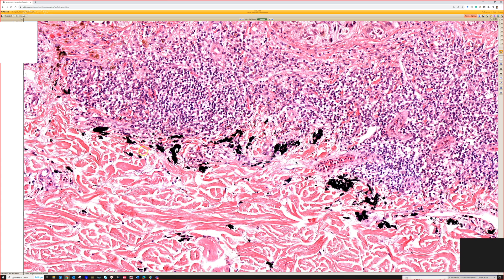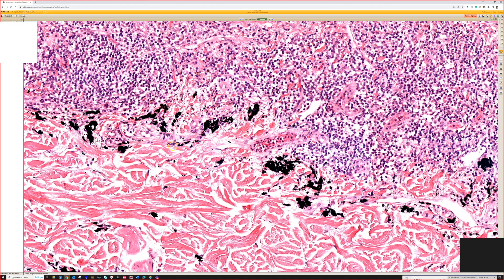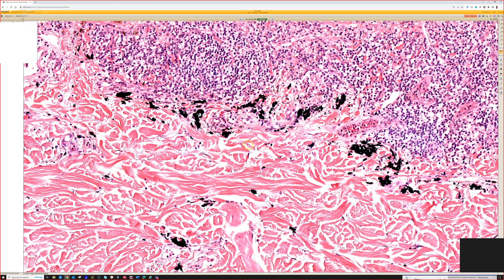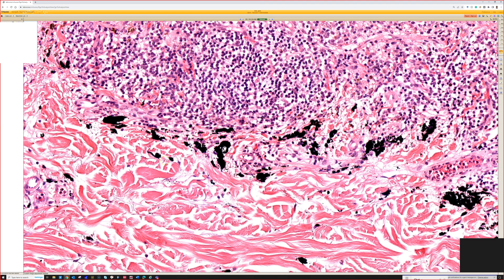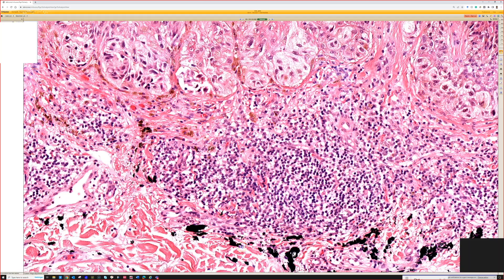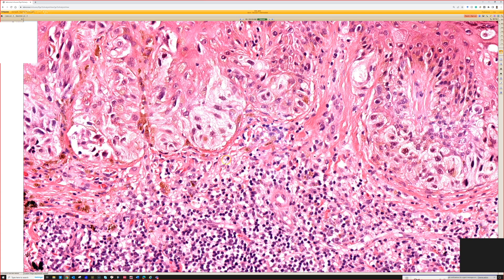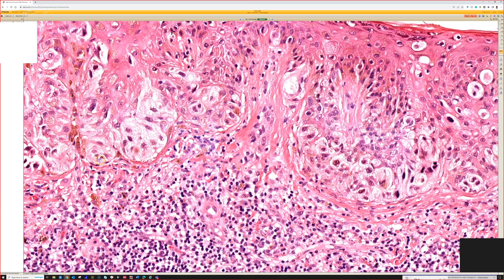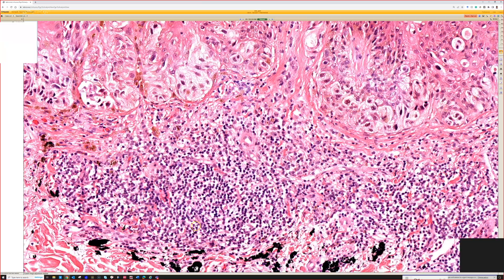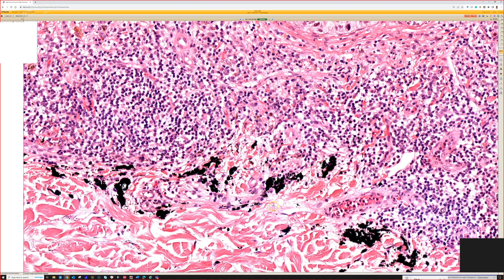Black can be carbon in the lungs from breathing air in polluted environments — most people have a little bit of carbon. It can be silver from drinking colloidal silver because you think it'll cure diseases — it does not, by the way. It can be foreign body, it can be tattoo pigment as in this case, or graphite from getting stabbed with a pencil. But black is not made by the human body. Melanin, no matter how black a melanocytic lesion looks to the naked eye, is always brown.